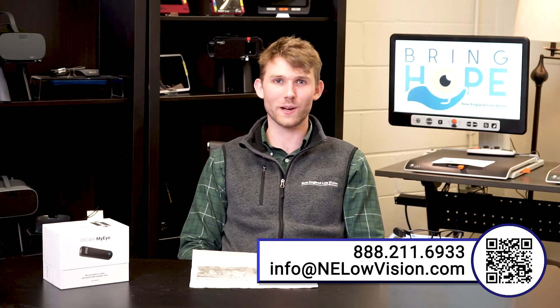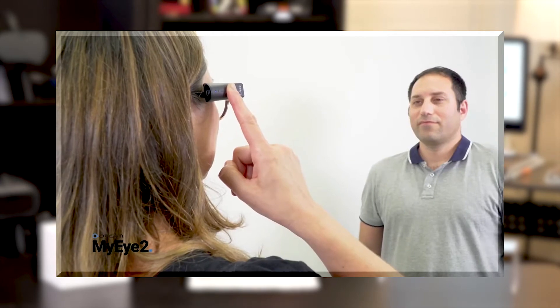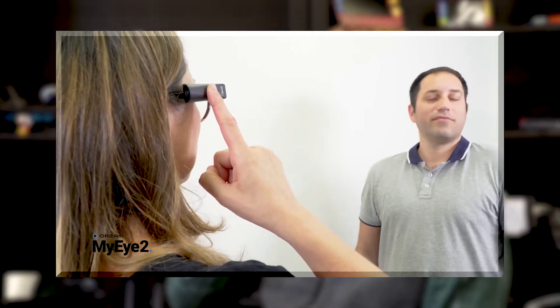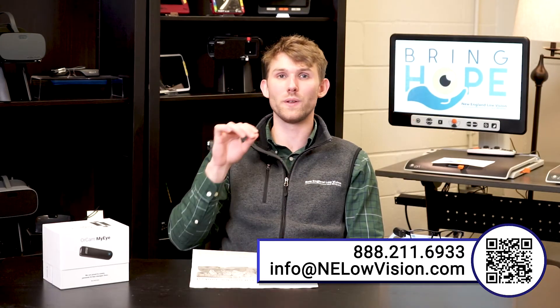The next major function is face recognition. To use it, you initially load people onto the device by pressing and holding the sidebar for about 30 seconds while the person is in front of you. It will beep and keep taking pictures as they move, talk, and look around so it can get a good scan of their face. Then it prompts you to say their name, records you saying it, and associates that audio with the pictures taken. This gives people with low vision more independence in navigating and talking to people.